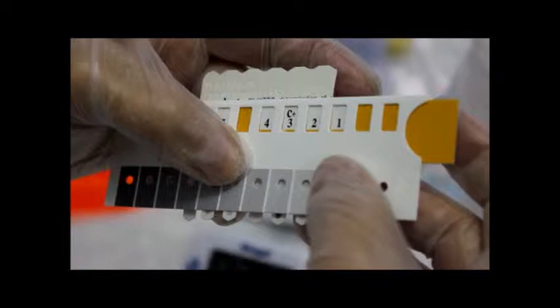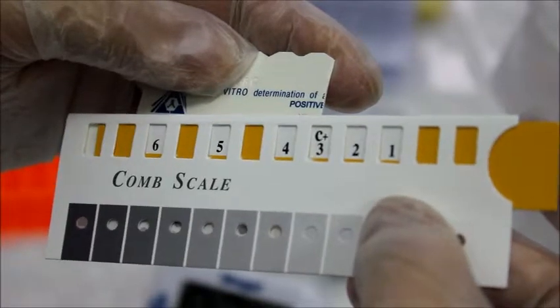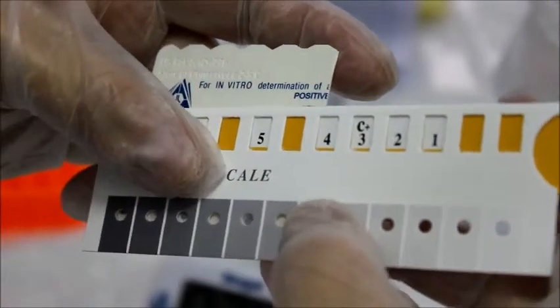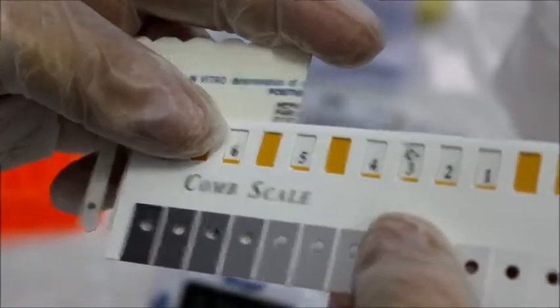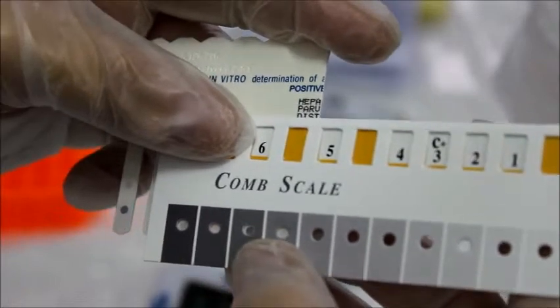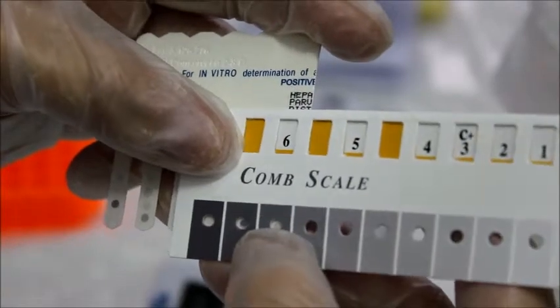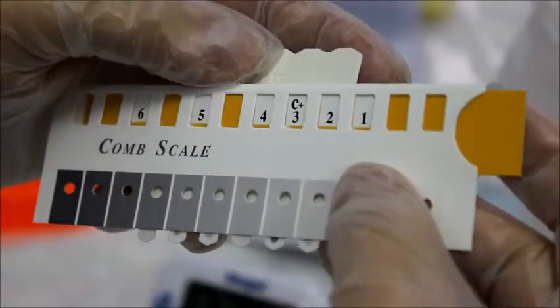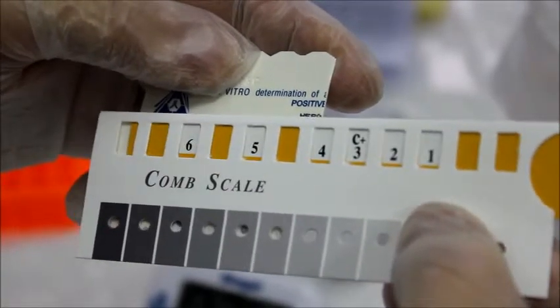While holding the slide, find the tone of purple-grey on the comb scale that most closely matches the desired test result spot, one of the lower spots. In other words, compare the colour tone of the test spot with the positive reference spot on the comb scale. The comb scale S value is the number that appears in the yellow window corresponding to the colour tone when the positive reference colour is calibrated to S3. So test numbers will range from S0 to S6.